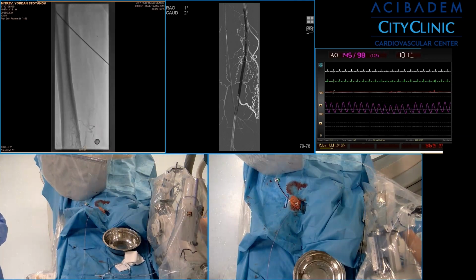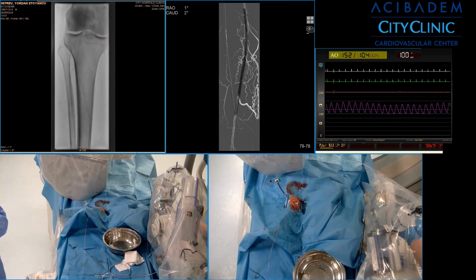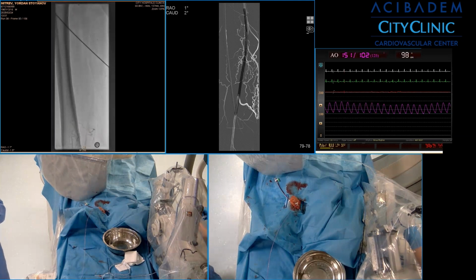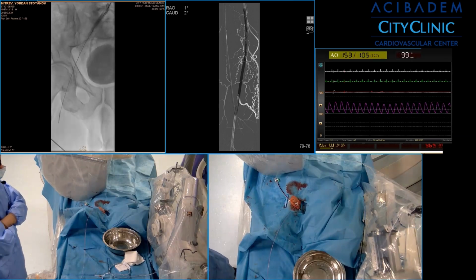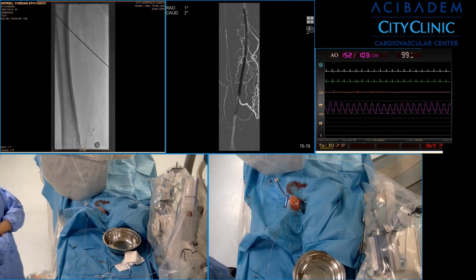It's better to go slowly and a little conservatively, so as not to put a 6-millimeter balloon from the beginning, because the dissection is absolutely a definition. It's not a probability. It's a definition. But in this case, it's the big guy. So the 5-millimeter balloon is exactly one-to-one.